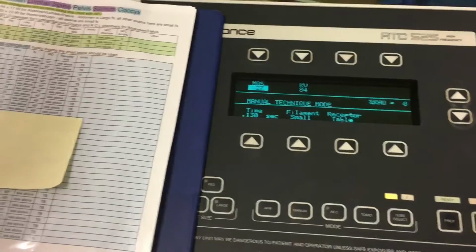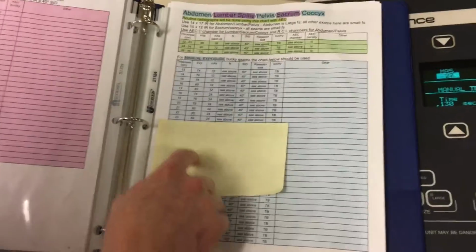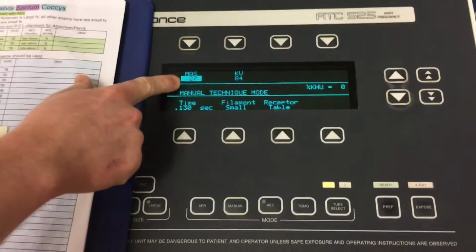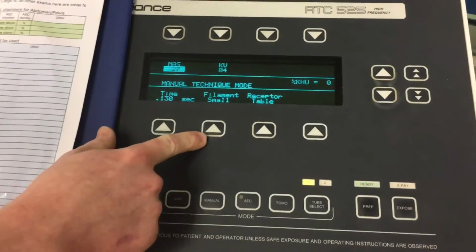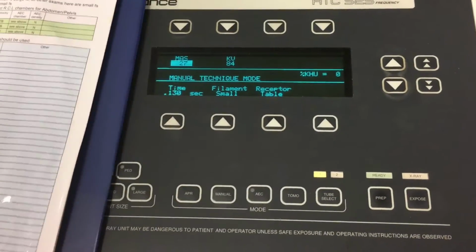Alright, so now we're at the control panel. I got 23 centimeters. I'm using the pelvis page in my exposure technique chart. Setting 84 kVp at 24 mAs. Had to go with 27 because that was the closest I could get. Using a small filament again to show bony detail, and we're on table receptor now. Breathing instructions for this projection are suspended respiration, and that concludes my video analysis.